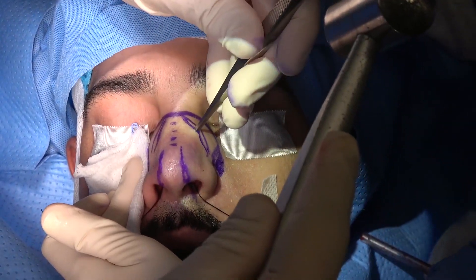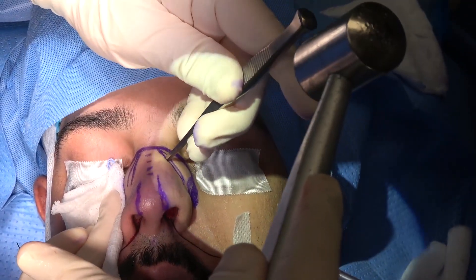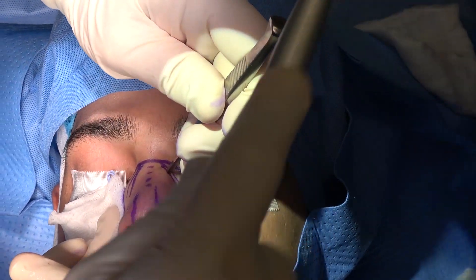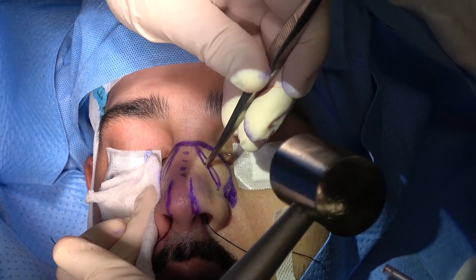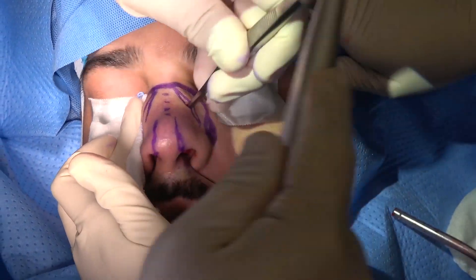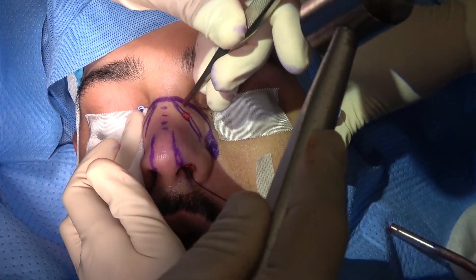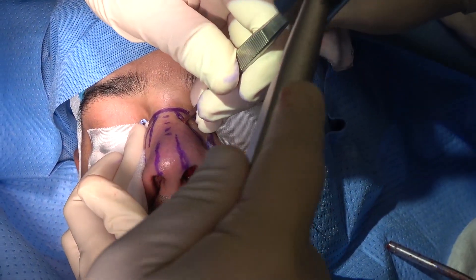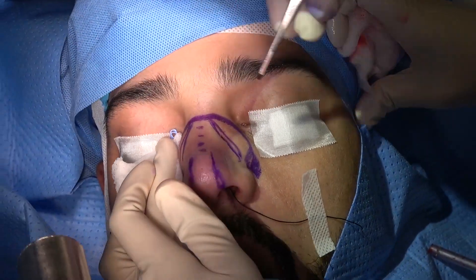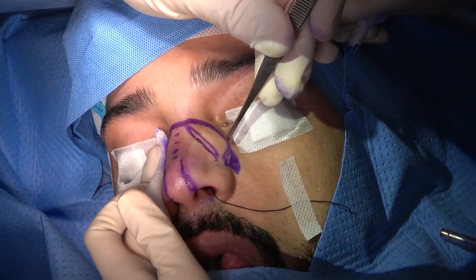So again, it's like pressing on the egg — going through the skin, the periosteum, and the bone, but not through the endosteum and the mucosa. Again, we go about two millimeters below for the lower mid-lateral osteotomy, keeping the inside membrane. So we have done the two double mid-lateral, and now we go to the lateral osteotomy.